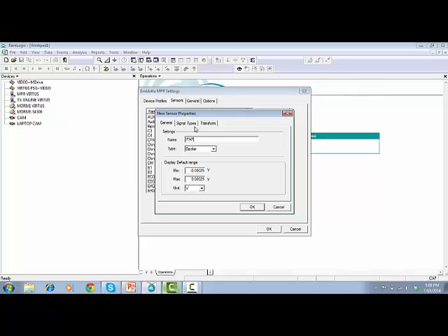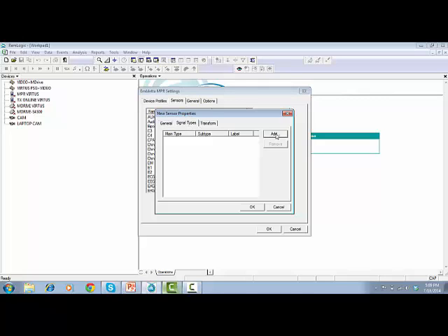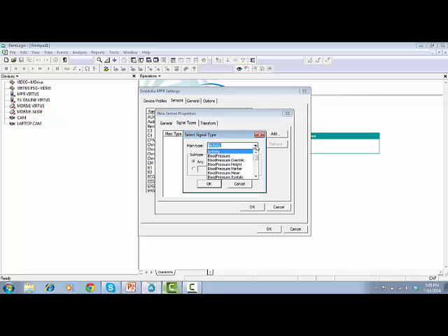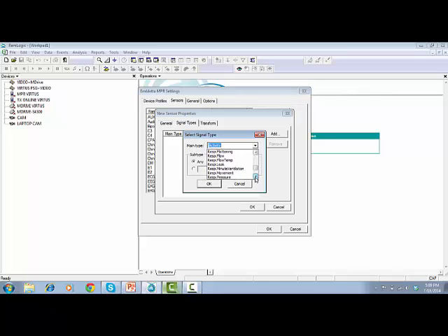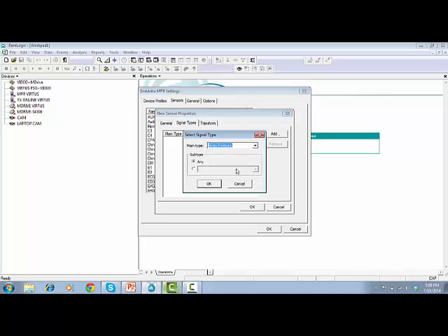On tab Signal Types, click on Add. Signal Types window will pop up. Select the proper main type. In this case, we'll choose Respiratory Pressure.